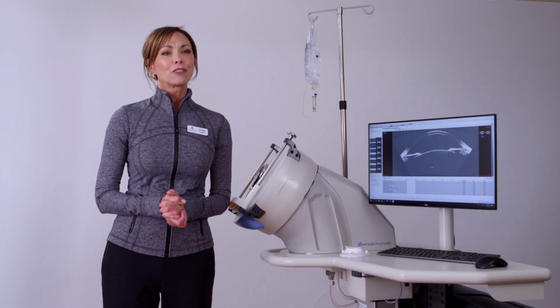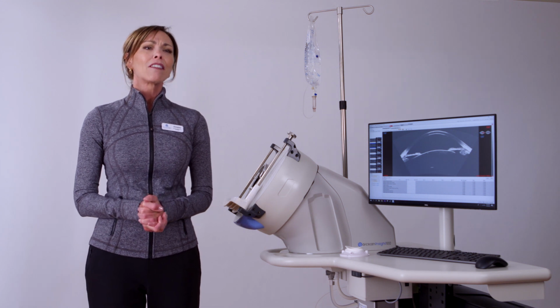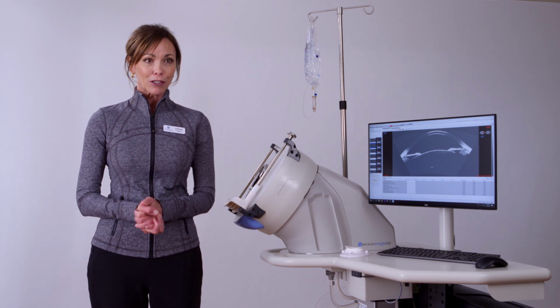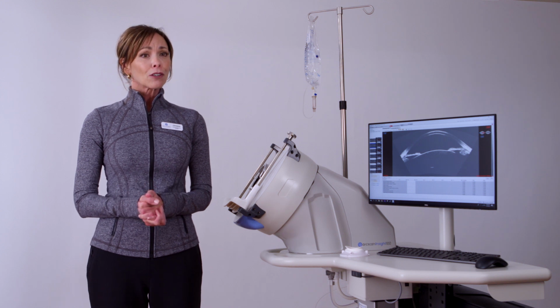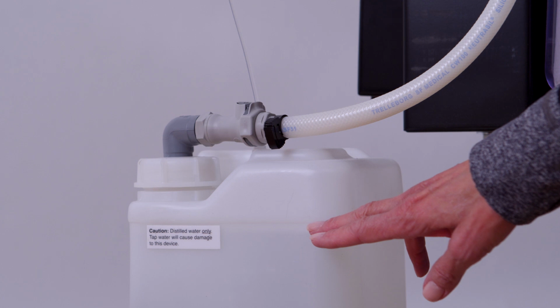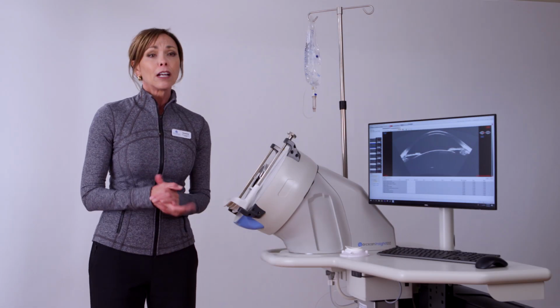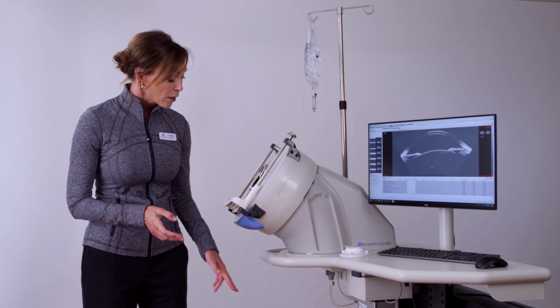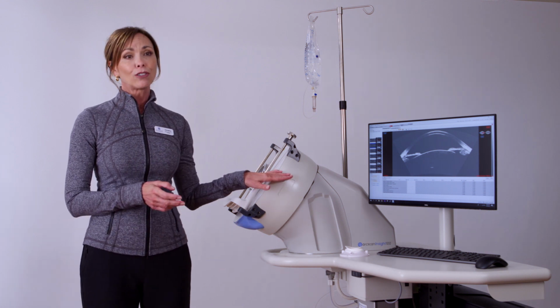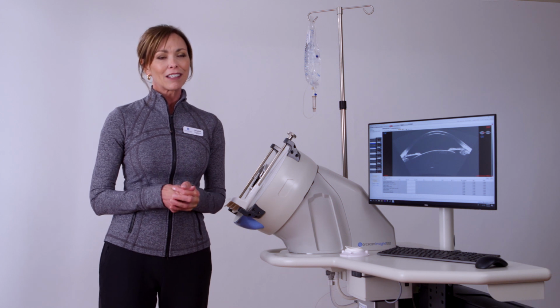As I introduce you to the Insight 100, I will point out the various components that produce the highly detailed ultrasound images for you to analyze. First, the computer, software, and monitor, then the fluidics module. The distilled water in this reservoir is one of two fluids. It will be drawn up through this filter and into the scan head. The distilled water does not come into contact with the eye.